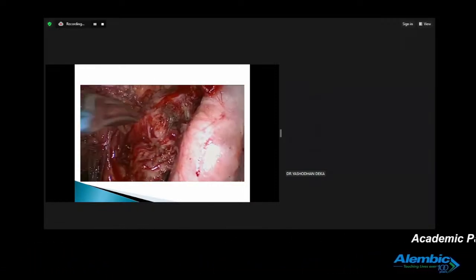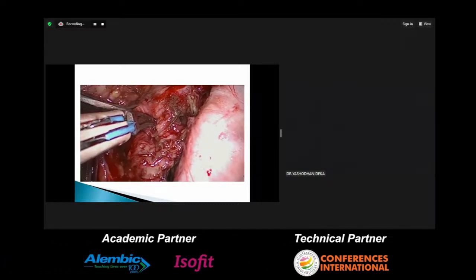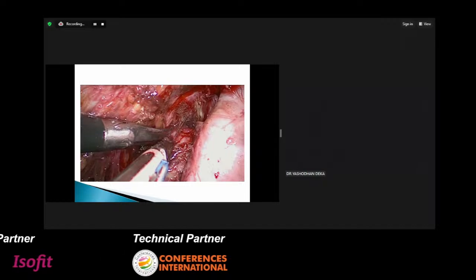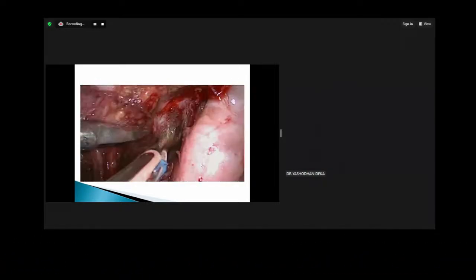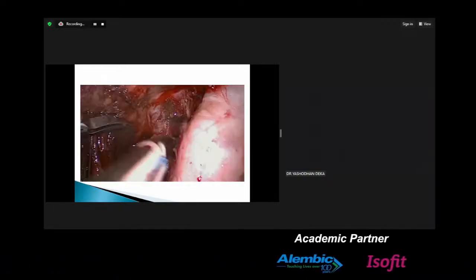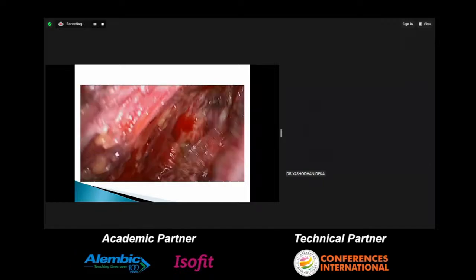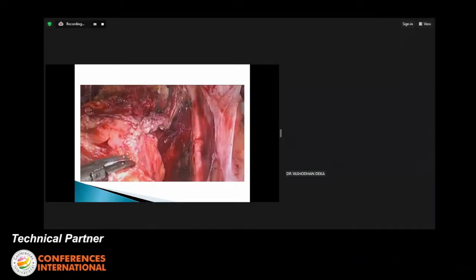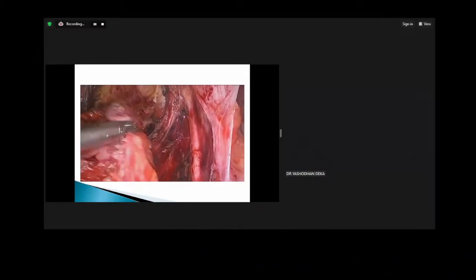Earlier, we used to think that maybe the field is more bloodless and it helps you lessen the bleeding, but I don't think it does. I think it practically takes you in the wrong plane sometimes, and it's a false sense of security to use vasopressin at this point of time. So you just go on cutting. You identify the rectovaginal space. Sometimes when the vagina is also involved, then what you have to do is put a finger in the vagina, feel the nodule, and then cut it through. Okay, so that's the entire nodule.